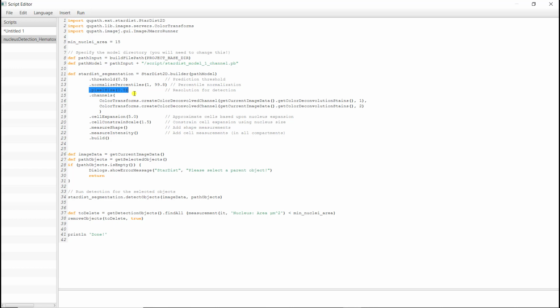That's really nice because one thing that doesn't work well with deep learning is that, although you can find strategies from the people who worked on this, most of the time it's going to be defined for a certain range of size. So if you change the scale of the object you're looking for, it's not going to work, except if you somehow change the scale of your images. So that's really a nice feature.